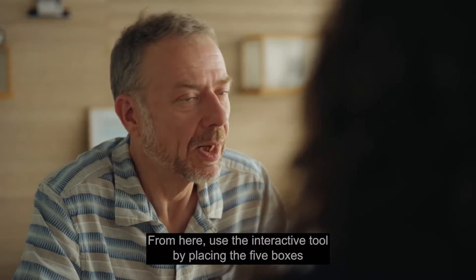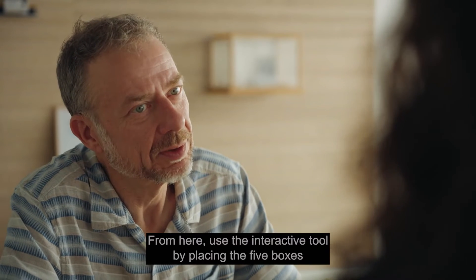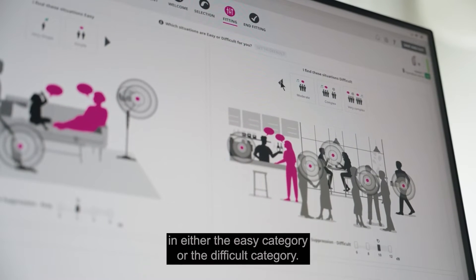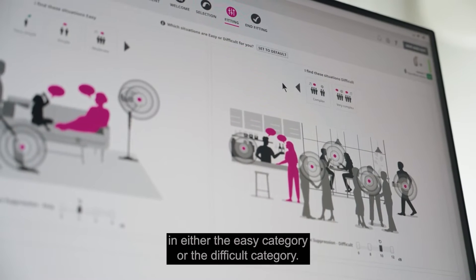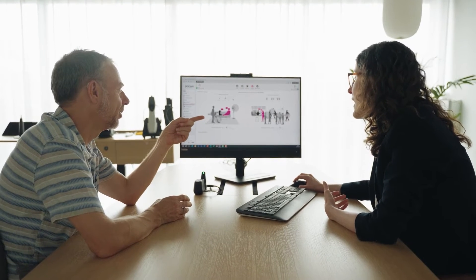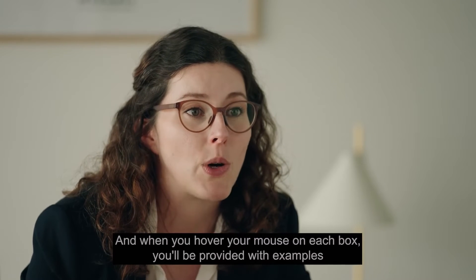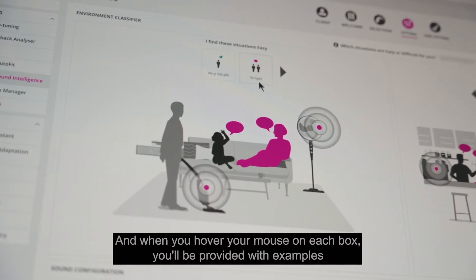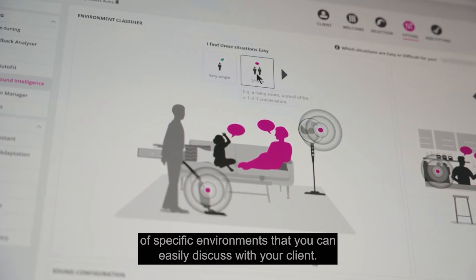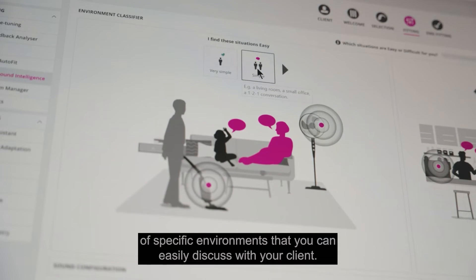From here, use the interactive tool by placing the five boxes in either the easy category or the difficult category. When you hover your mouse on each box you'll be provided with examples of specific environments that you can easily discuss with your client.